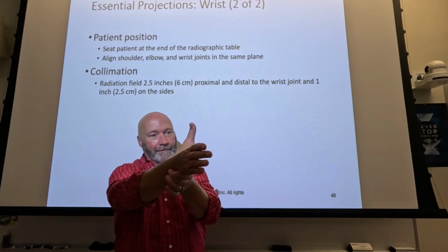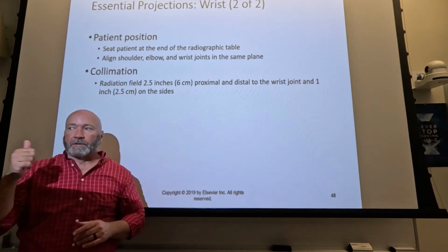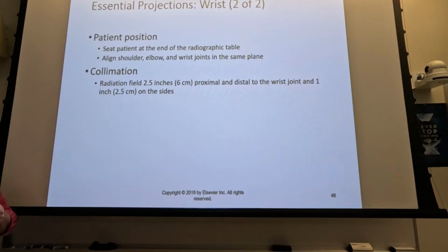And I'm talking about a little bit. We're going from here to there. It gives you a better wrist. Okay? So PA, 45-degree oblique, that's external rotation. One thing about the oblique, what it will show you better than the other two projections is a potential fracture of the scaphoid. So where are most of your wrist fractures? The radius and ulna. Most common wrist bone that's fractured? Scaphoid.